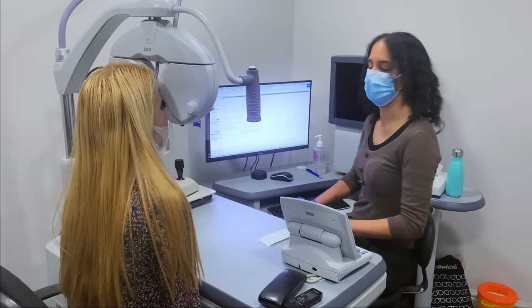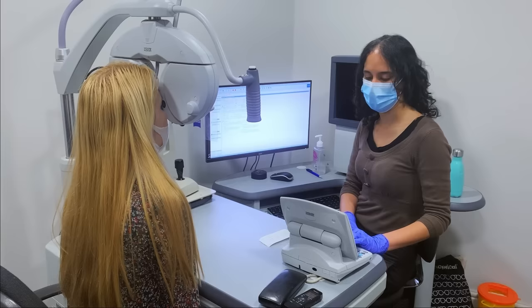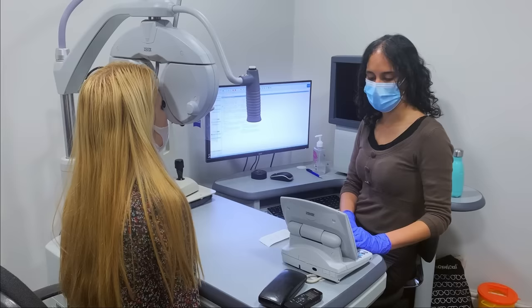Okay, very good, excellent. So let's unblur this eye now. So looking at the middle line with both eyes together, is it clearer with number one now, or clearer with number two? Number one. Good, and then between number three now and number four? Or is number four just smaller? Yeah, number four, I think, is just smaller.